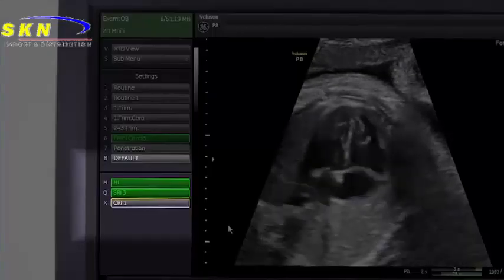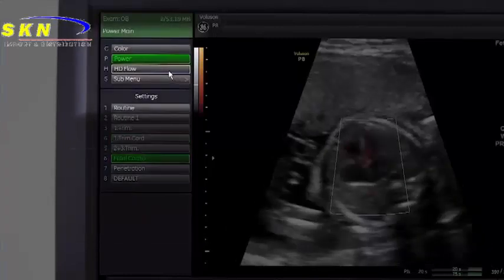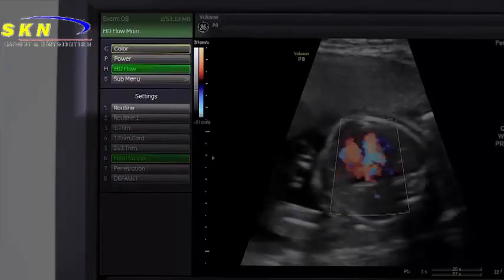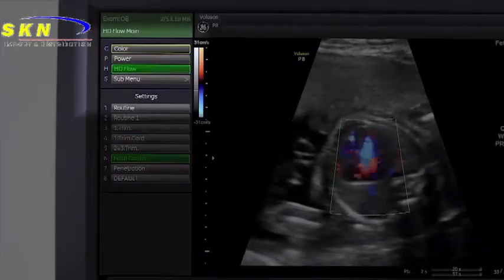Functions such as Harmonix, Power Doppler, and HDFlow can be found in this display menu.